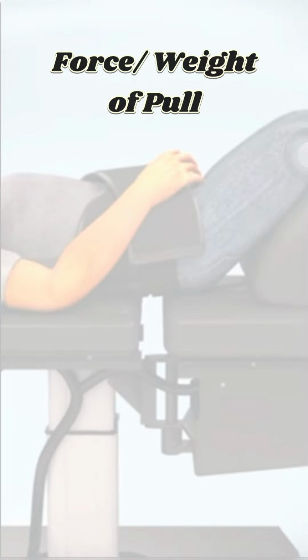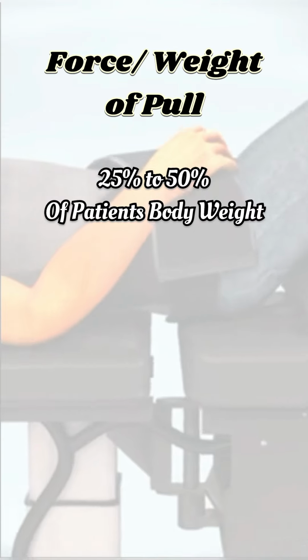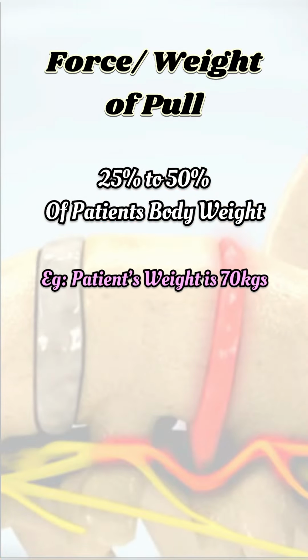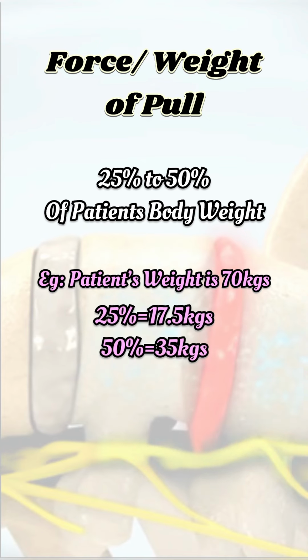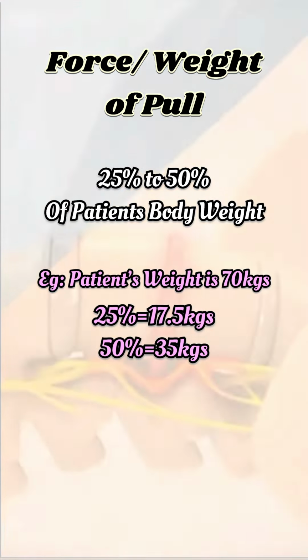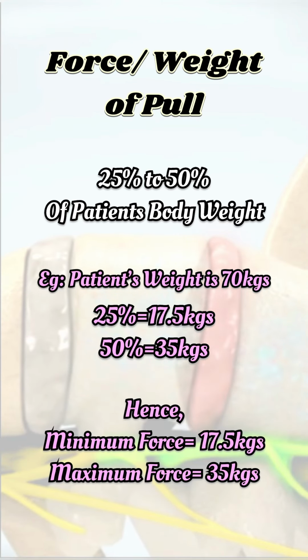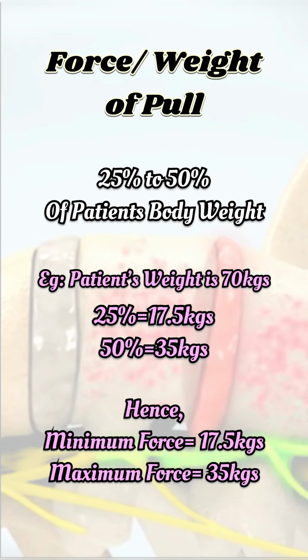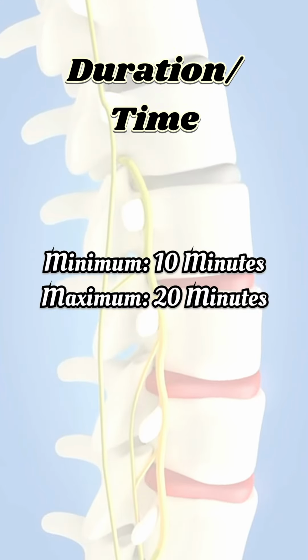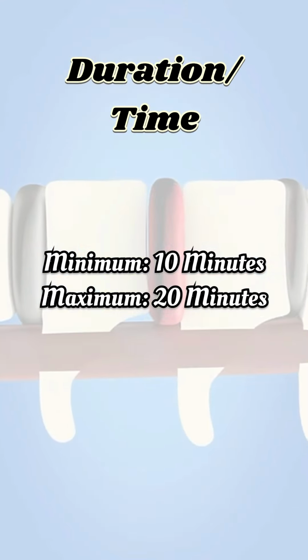Let's talk about how much traction force should be given. It's from 25% to 50% of the patient's body weight. Well, if the patient's weight is 70 kg, then 25% will be 17.5 kgs and 50% will be 35 kgs. The amount of traction that you can give minimum is 17.5 kgs and maximum will be 35 kgs. So in between, however much the patient can tolerate can be given. So now the time for giving the traction could be from 10 minutes to 20 minutes.